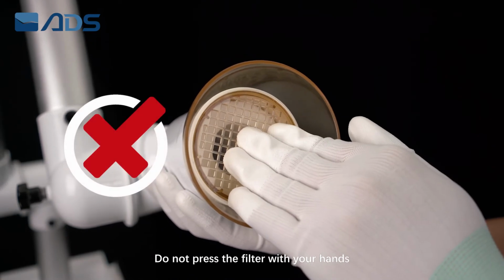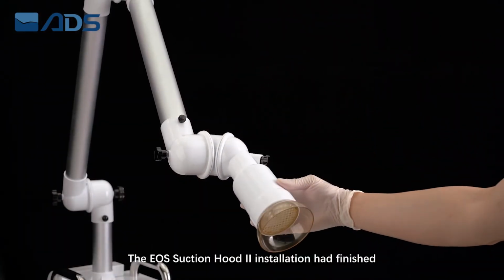Do not press the filter with your hands. The EOS Suction Hood 2 installation had finished.